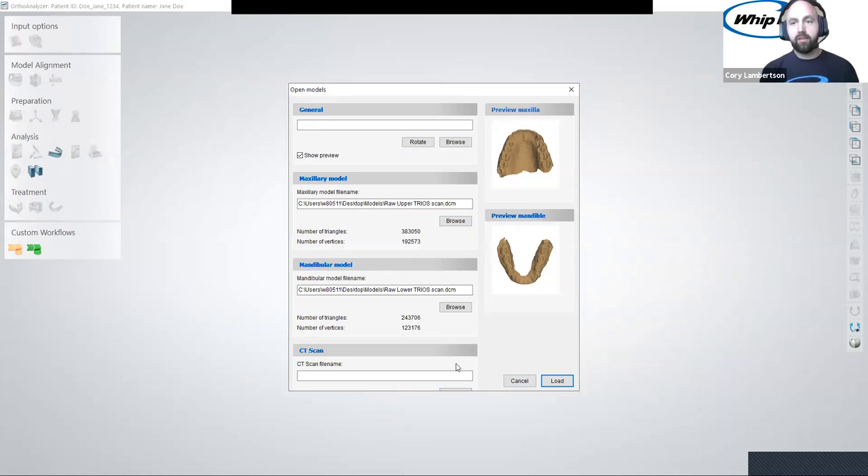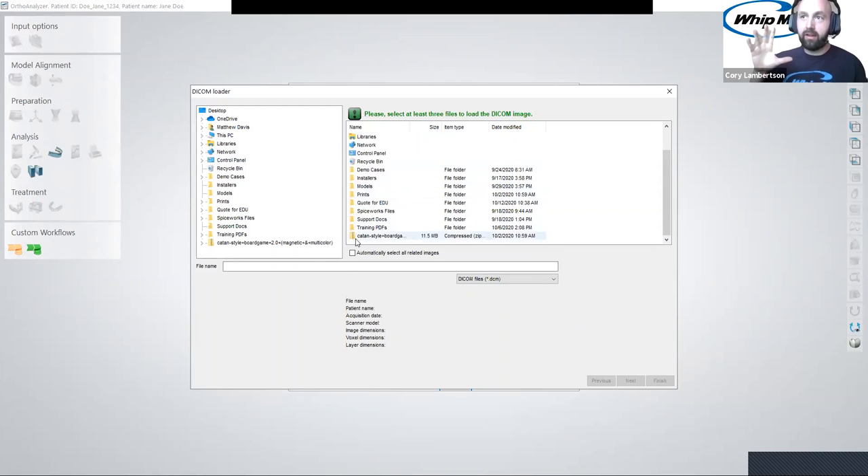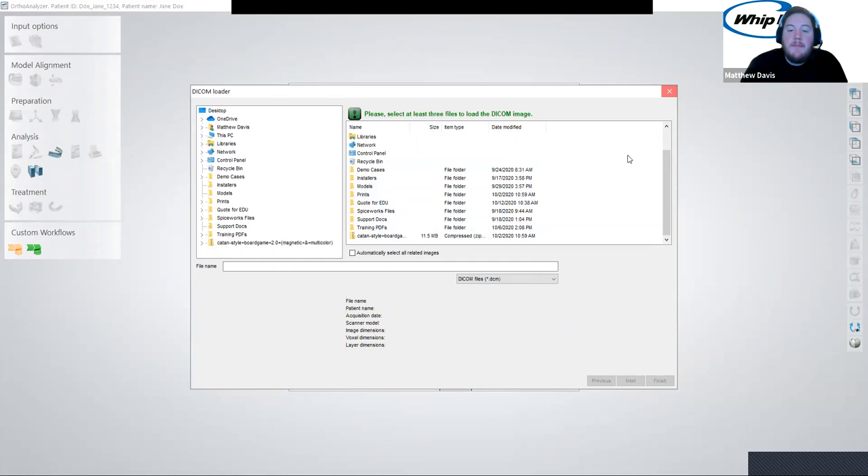Is there a specific format the CT scan needs to be in? It says DICOM — that's the only file type it accepts. You don't have to select all of them individually; you just select the folder where it's located and it'll automatically import all of those images. Can you imagine having to upload every single image? I've seen software where you had to highlight all of them, and if you missed one, it wouldn't load — very frustrating. If you have any questions at any time, please feel free to ask.